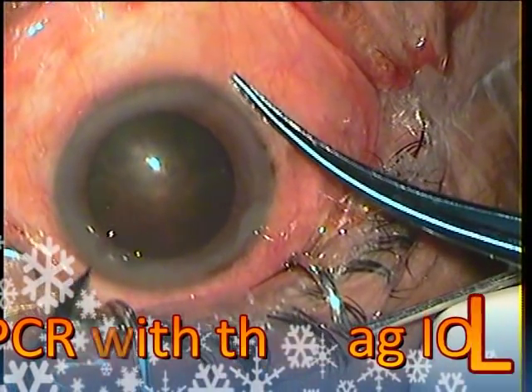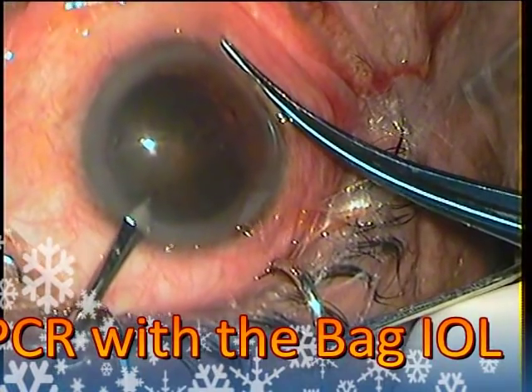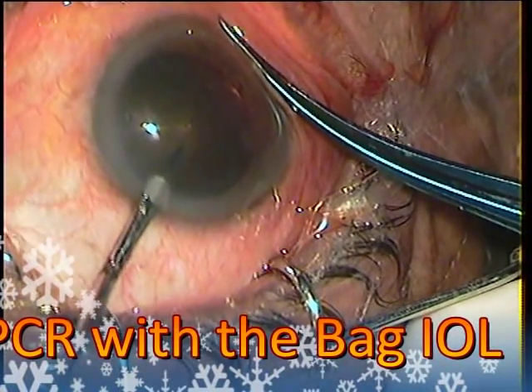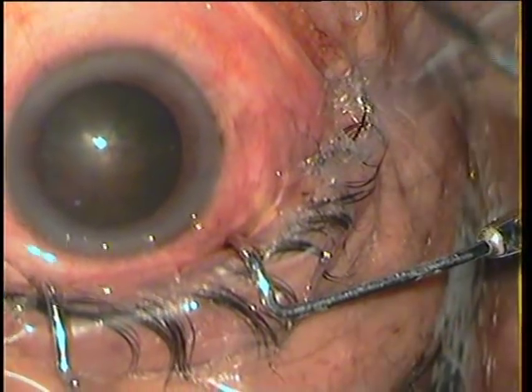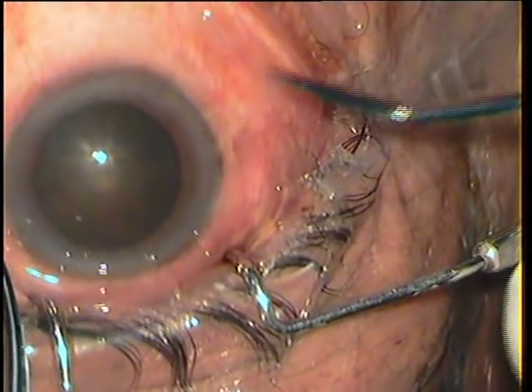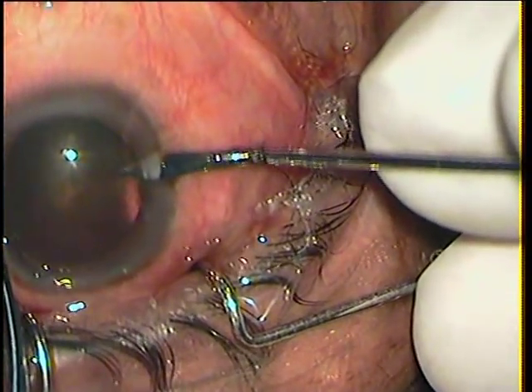Dear friends, in this video I shall be showing a case in which I had a posterior capsular rent but could manage to implant an in-the-bag IOL. I am 13 years into phacosurgery and yet learning steps every day.